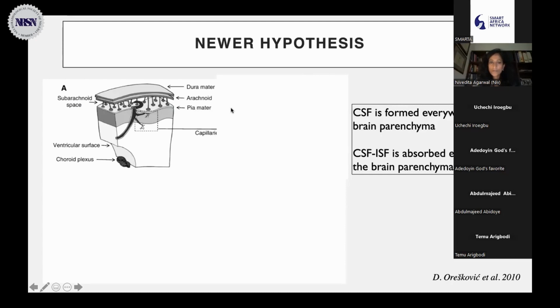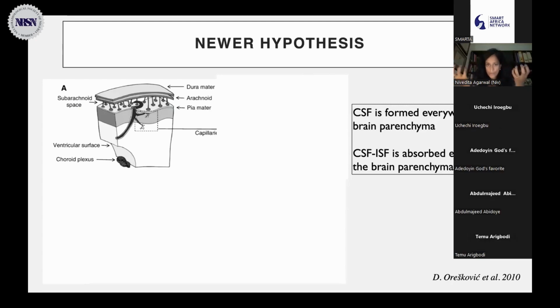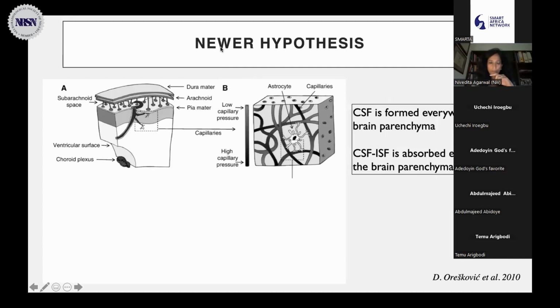How would you differentiate transependymal leak from periventricular white matter changes in the early phase? It's absolutely not easy, but it is a matter of identifying all the indirect signs. You're looking at the morphology of the ventricles. Are they rounded off? You're also correlating with neurological symptoms. How much is the white matter? What is the morphology of the white matter hyperintensity? We'll talk more about this as we keep going forward. You'll hear more about white matter hyperintensities.